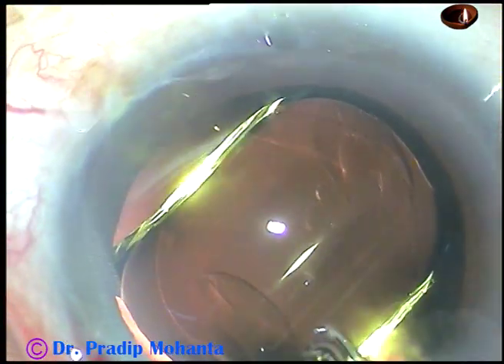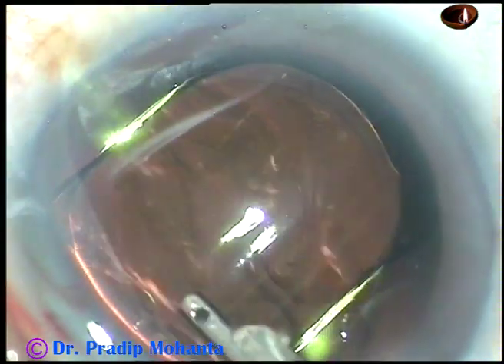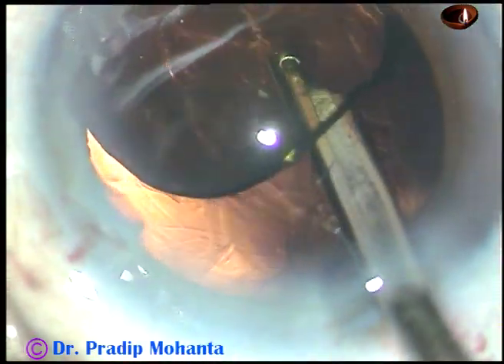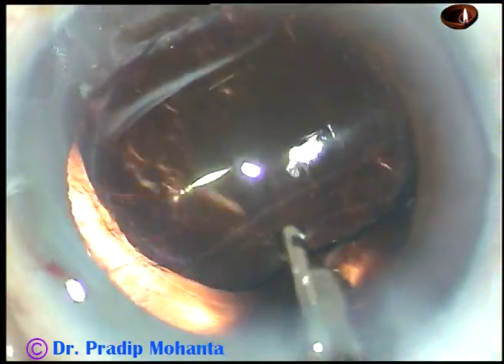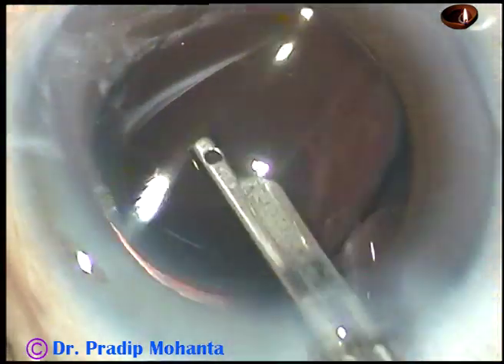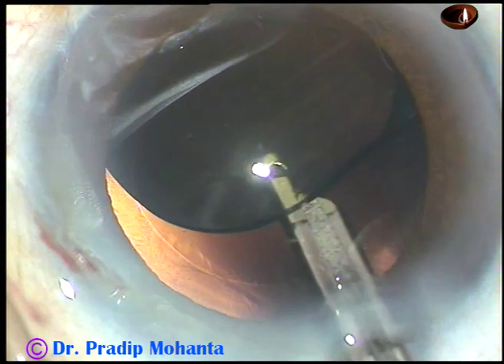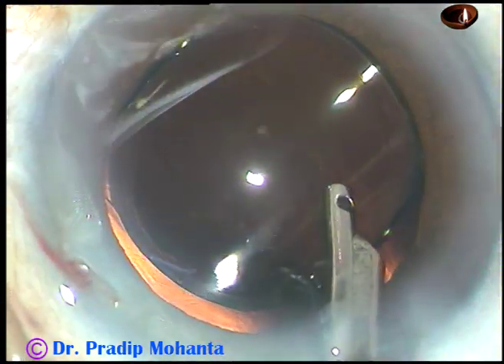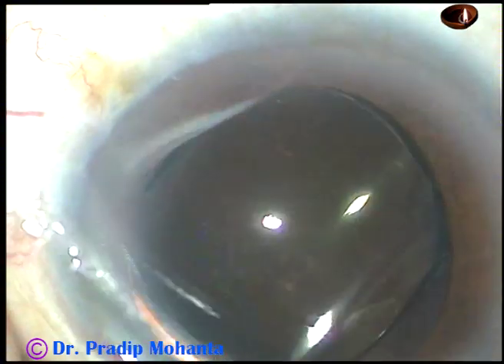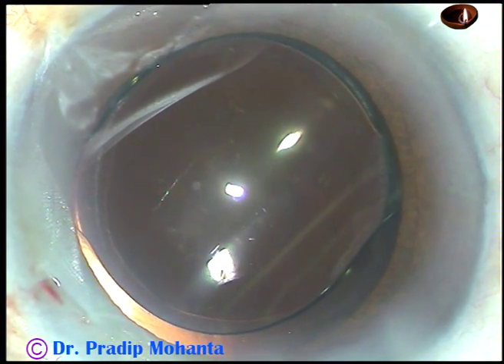And now the viscoelastic substance that has been used to fill up the anterior chamber and the capsular bag has to be removed thoroughly. I use both Simcoe and bi-manual irrigation-aspiration to remove the viscoelastic substance, which is 2% HPMC. The 23-gauge Simcoe cannula is being used — first I irrigate the anterior chamber and capsular bag, then aspirate. About 70% of the viscoelastic substance comes out by this maneuver.